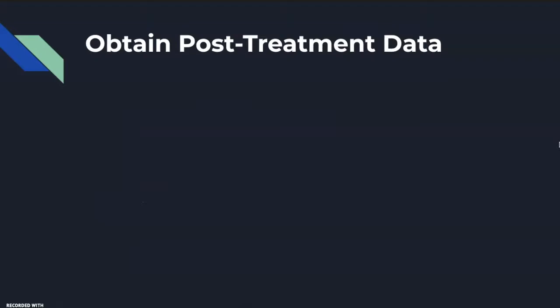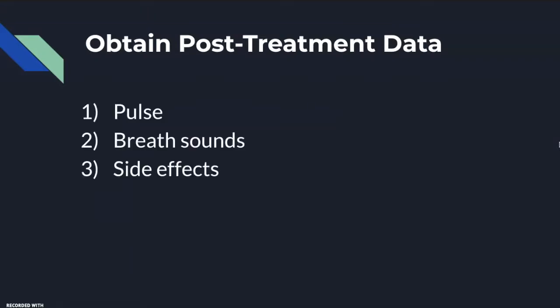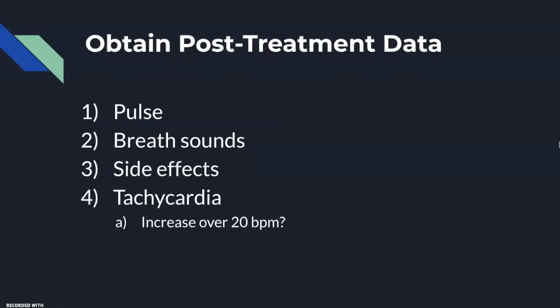You'll then obtain post-treatment data. This is things like the pulse, the breath sounds, and any side effects, and record that in the medical record. Once again, if the pulse is increased more than 20 beats per minute over baseline, you want to notify the physician.